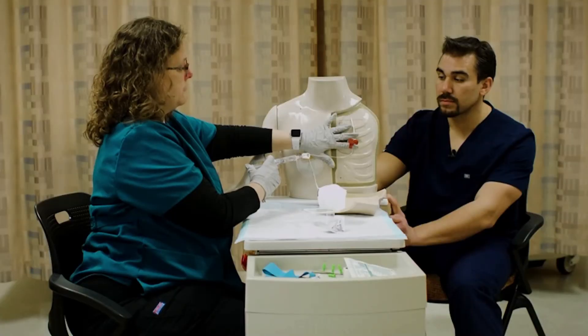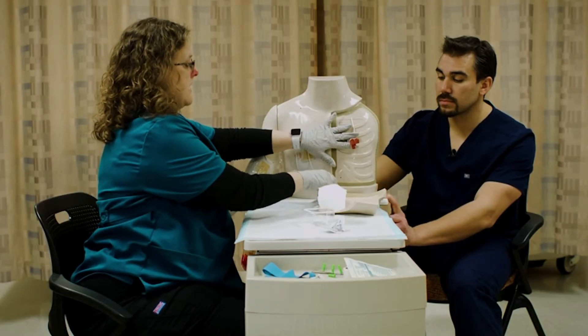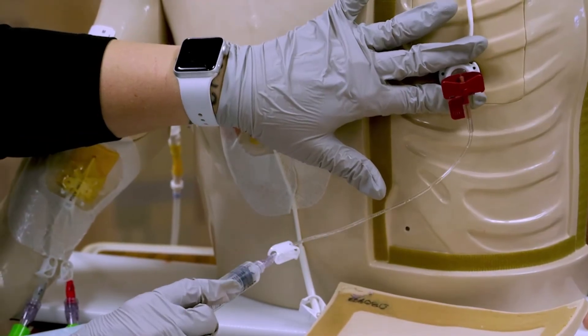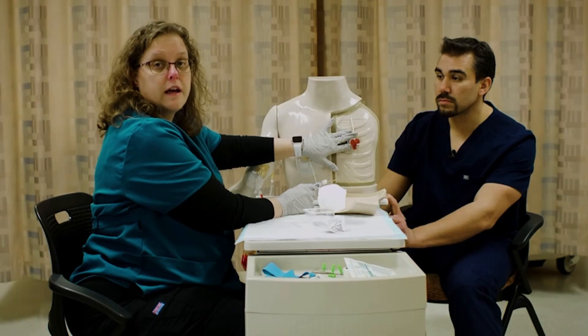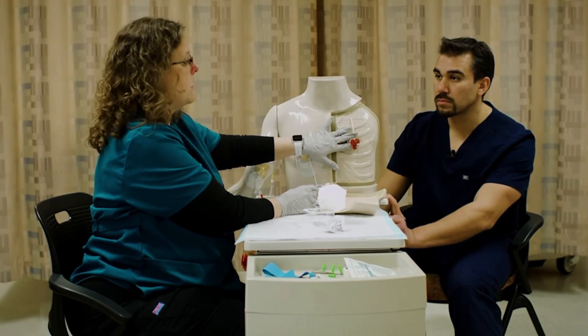Then I'm going to flush pretty forcefully, and then come back and flush with heparin as well — especially if I'm not going to go ahead and use it. If I'm going to hook it up to an infusion, then I don't need to worry about the heparin right now.